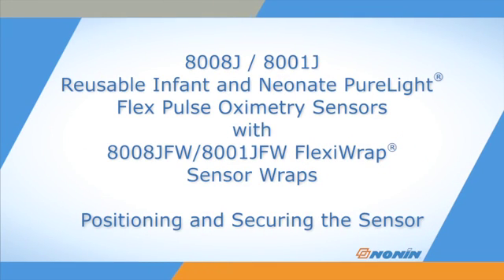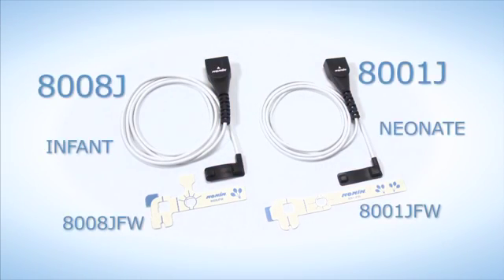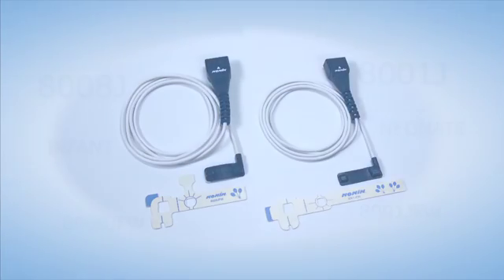This short video shows how to properly position and secure the non-8008J infant and 8001J neonate size sensors using disposable 8008JFW or 8001JFW FlexiWraps.